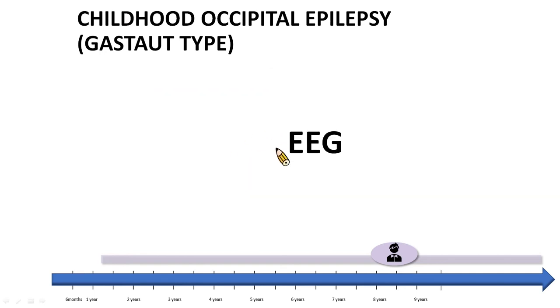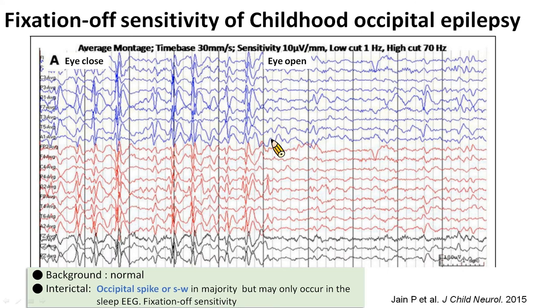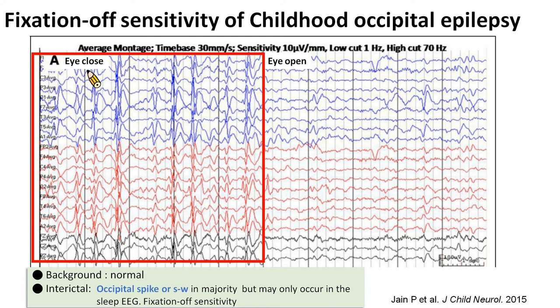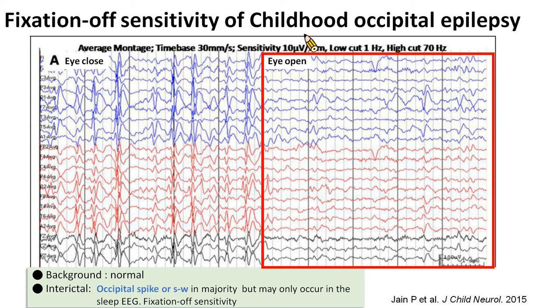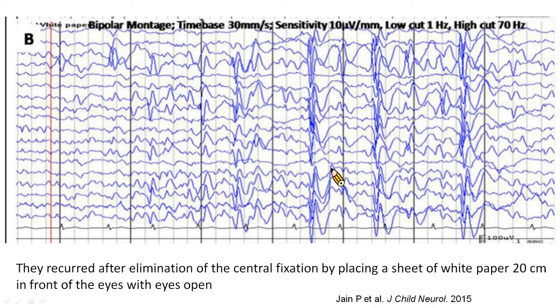Here is the EEG. The background is often normal. Occipital spike or spike-wave occurs in the majority but may only occur in the sleep EEG. Fixation sensitivity is a characteristic EEG finding in this syndrome. As highlighted by the red box, the epileptiform discharges persist throughout the eye-closed state, and later the discharges disappear with eye opening. However, the discharges recur after elimination of central fixation by placing a sheet of white paper in front of the eyes with eyes open.